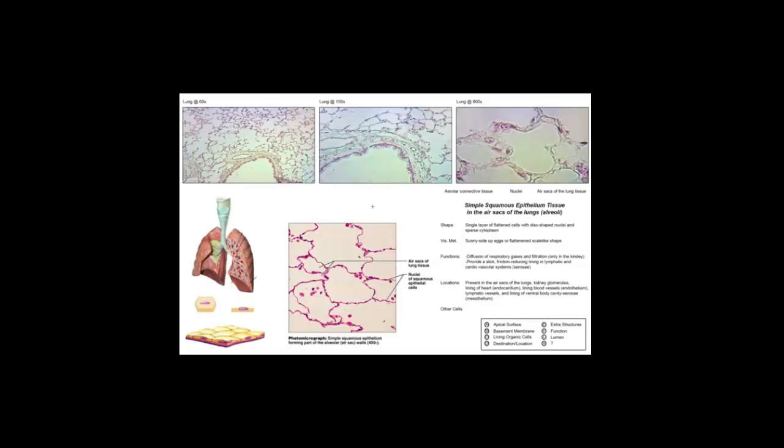Okay, all right, so in this slide, this is respiratory epithelia. We're going to see a transition from the trachea here and the pseudostratified ciliated columnar cells that are seen at low magnification right here that line the larger airways like bronchi and the actual trachea itself here into these smaller branches, the primary, secondary branches that we find here.